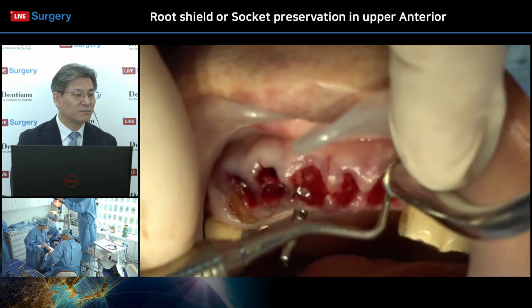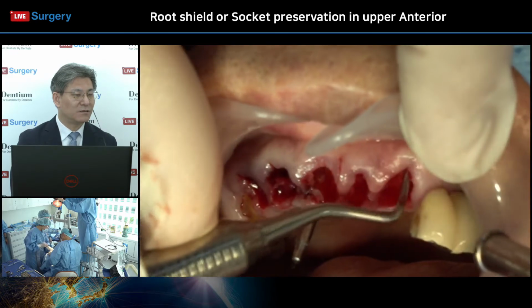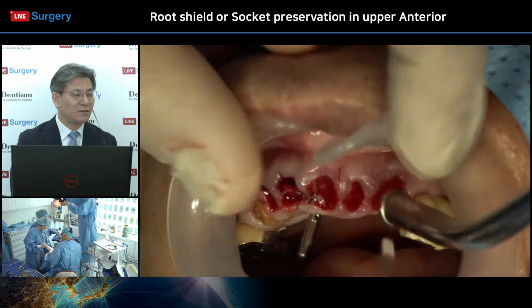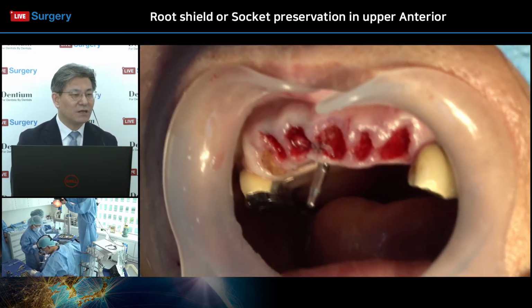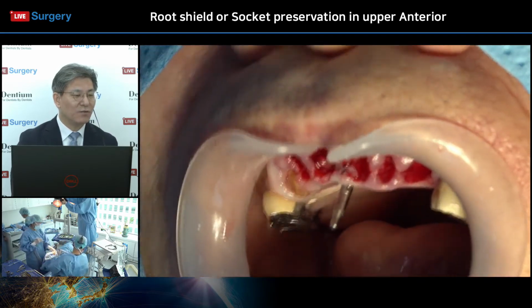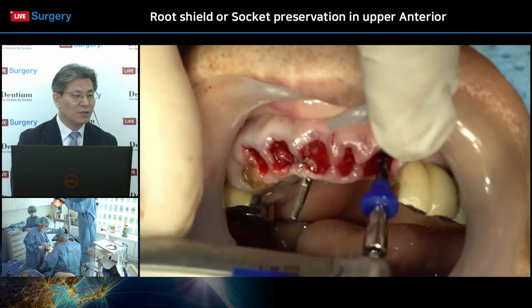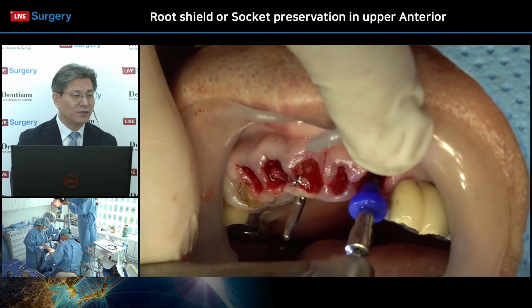Check the bone conditions. There is too much thin bone and no bone, so you must give a little bit of membrane coverage on this side. He can feel some penetration on the labial bone plate area, so he has decided on the GBR procedure after implant insertion.